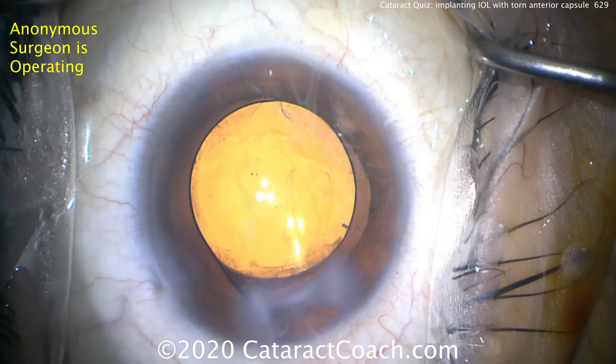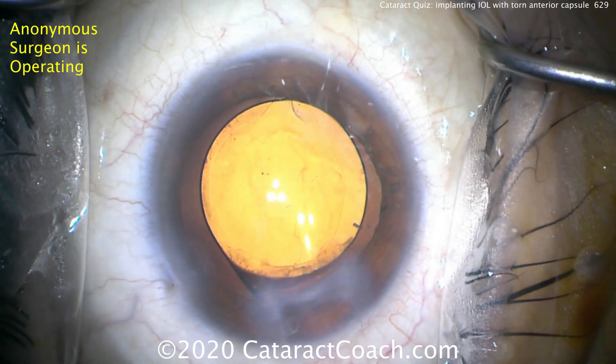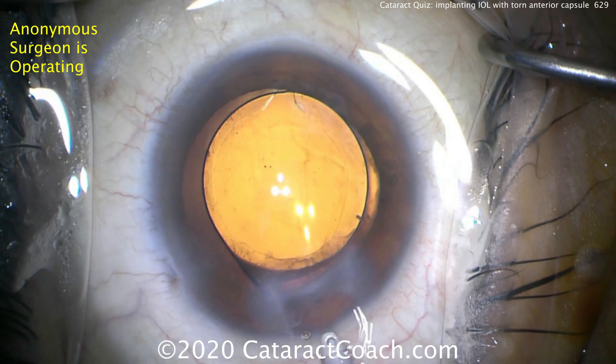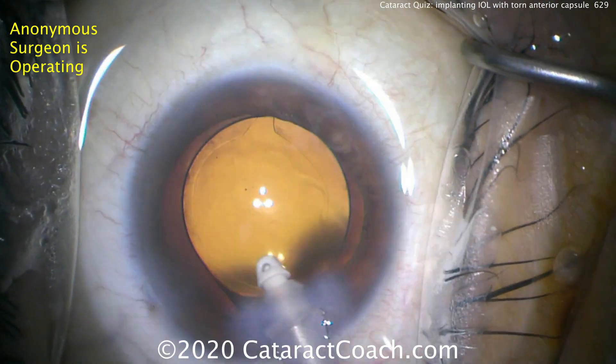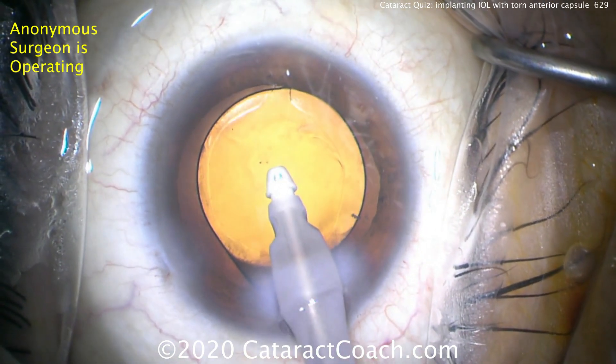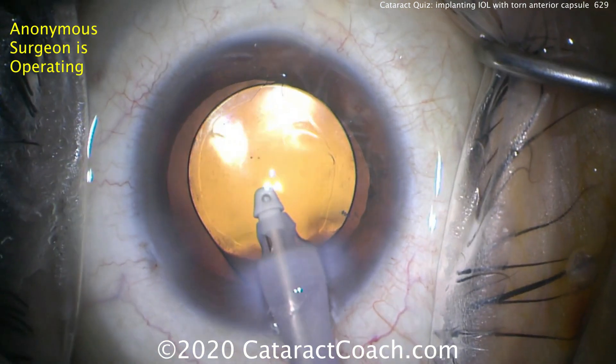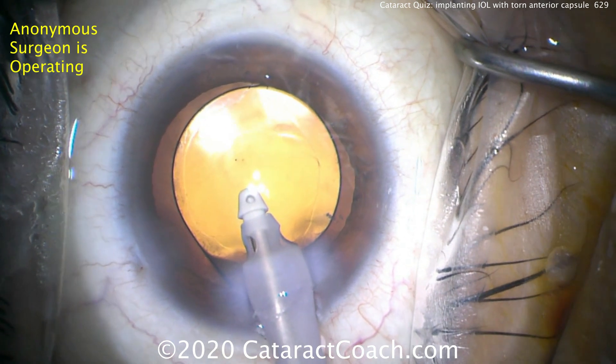Now notice: hydration of the incision — sealing the incisions while the eye is still full of viscoelastic. Why is that? So that when you go in the eye and remove the viscoelastic and come out of the eye, the incision is already sealed and it's not going to allow the anterior chamber to collapse.